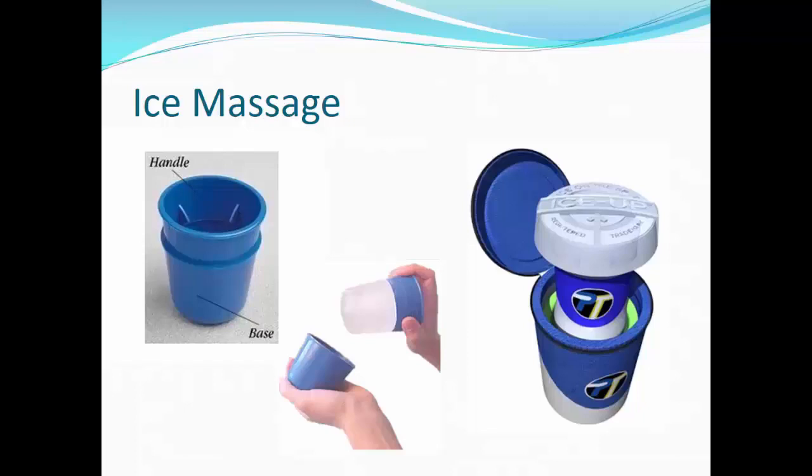The water is frozen in a push-pop type container, and then the ice cup is allowed to be pushed up as the ice gets used, in much the same manner as a push-pop ice cream container.